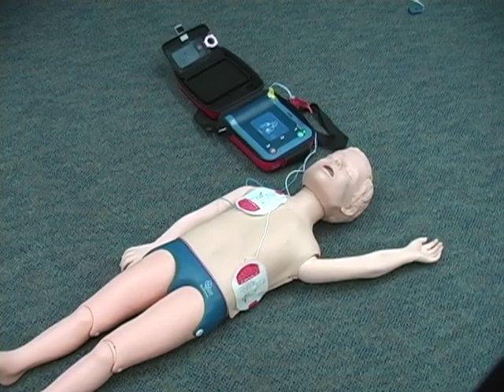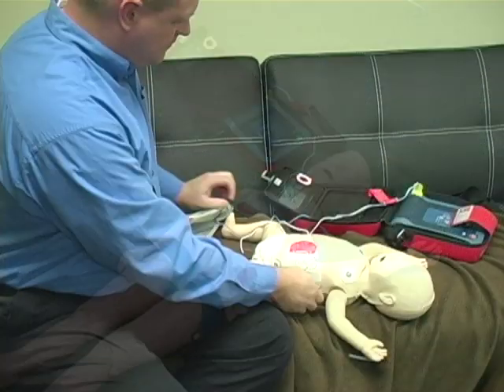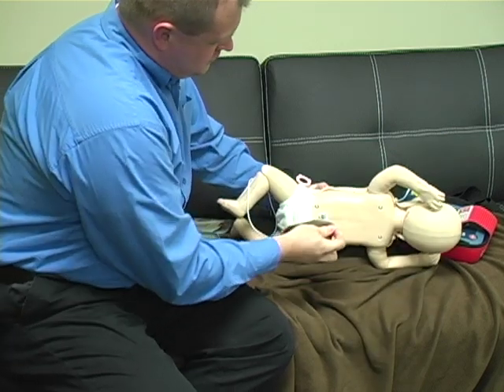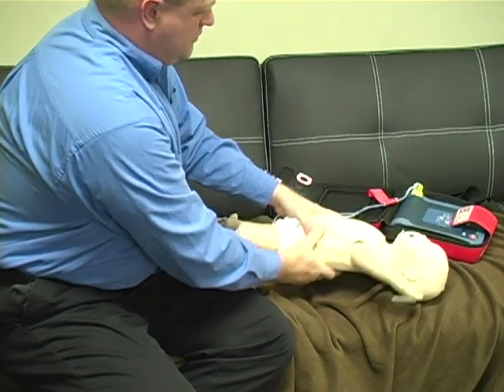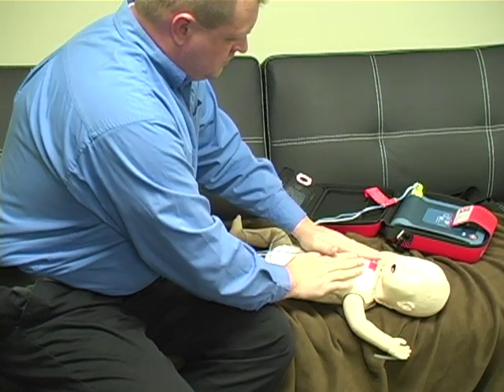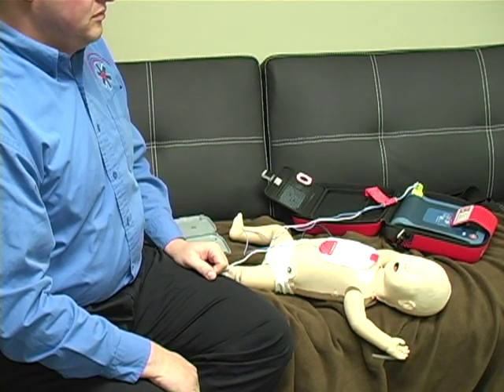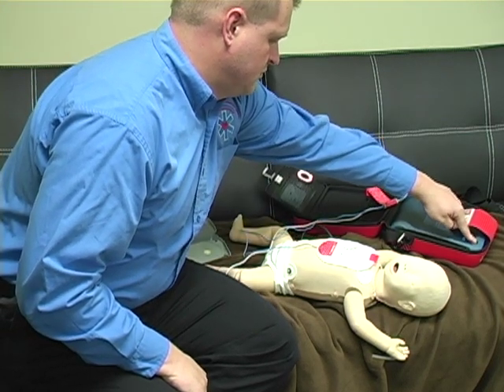This is the perfect place for the patches, but not the only place. As long as you are making a line through the heart, the patch placement should be okay. For small children and infants, you may not be able to fit both patches on the front. If this is the case, you should never cut the patches. However, there are other ways to make them fit. You can place one on the front and one on the back directly over where you think the heart is.